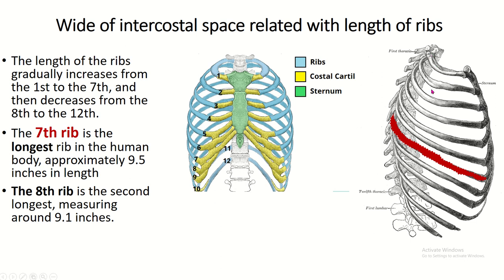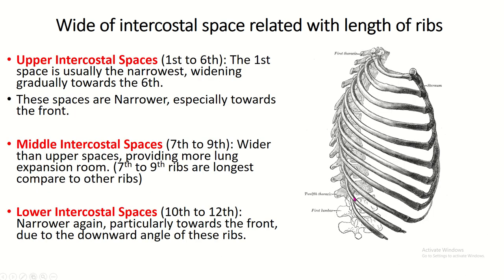You can see the first rib is the shortest and broadest, and gradually the size of the ribs increases, then again decreases. So the longest rib of the body is the 7th rib at 9.5 inches in length, and the second largest is the 8th rib at 9.1 inches in length. The upper intercostal space — the first space is usually the narrowest — gradually widens toward the 6th intercostal space. The middle intercostal space is wider than the upper space, and the lower intercostal space is narrower again, particularly toward the front.